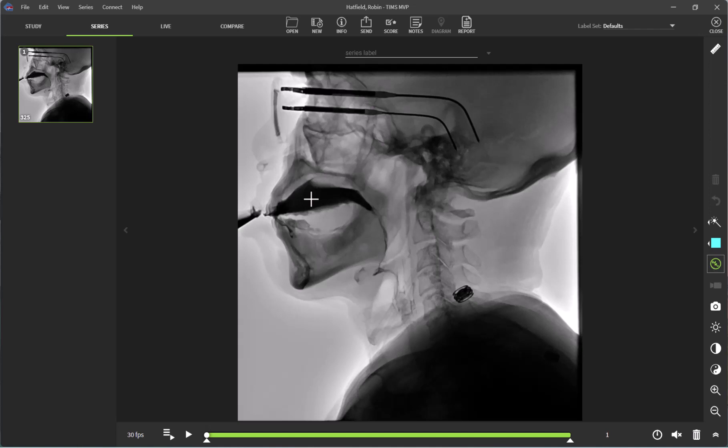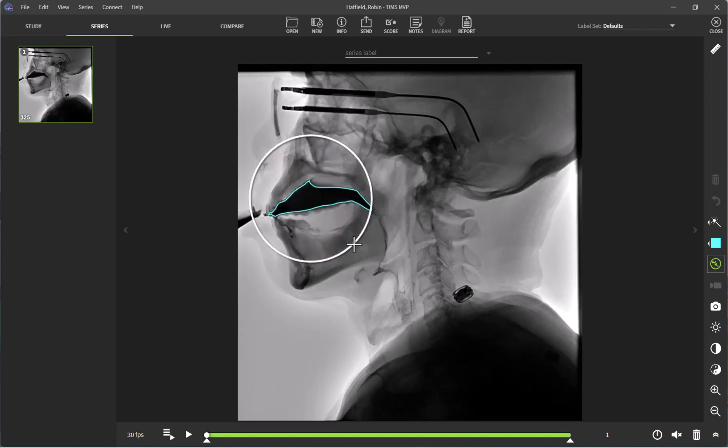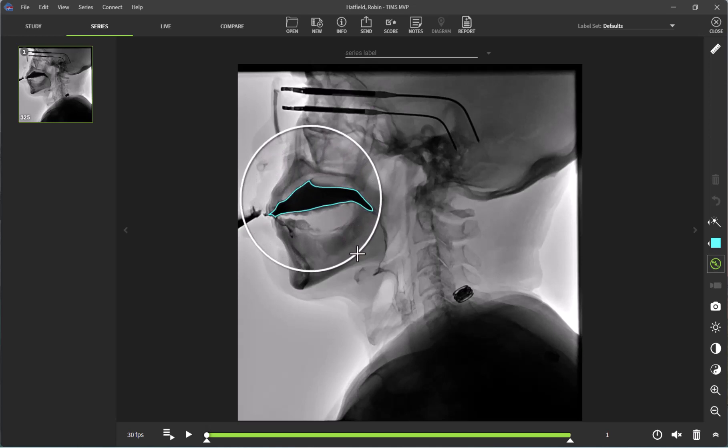To use this tool, I am going to click and expand out. As you can see, as I am moving my cursor out, TIMSS is automatically outlining the bolus for me.